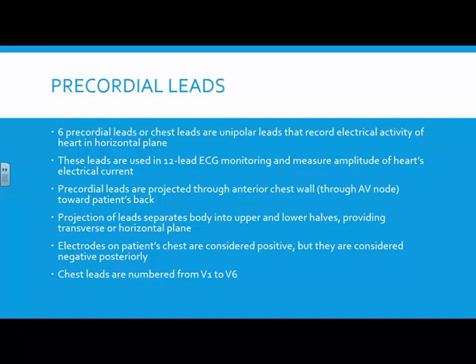Alright? With leads 1, 2, and 3, and those augmented leads, collectively they form the hexaxial reference system.